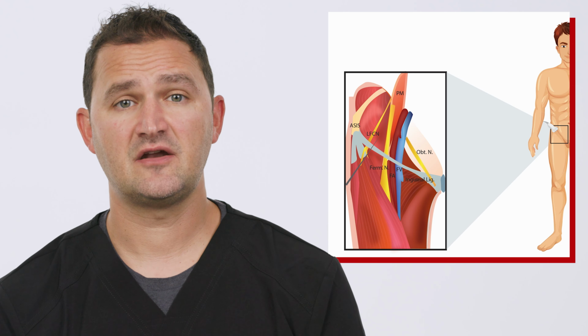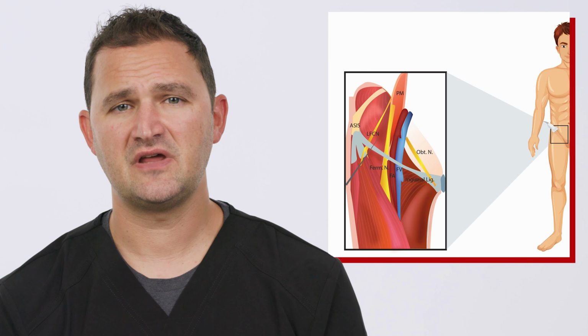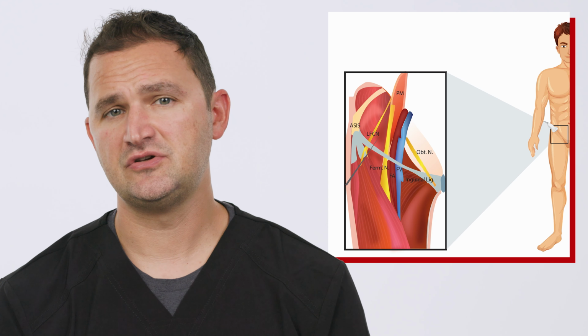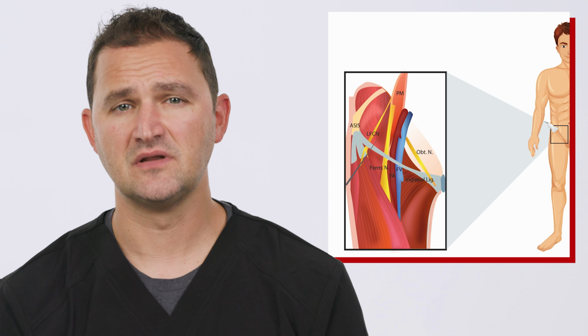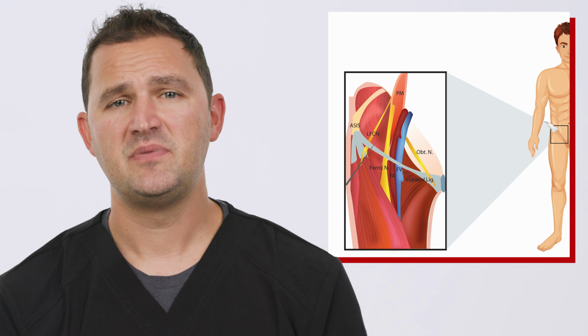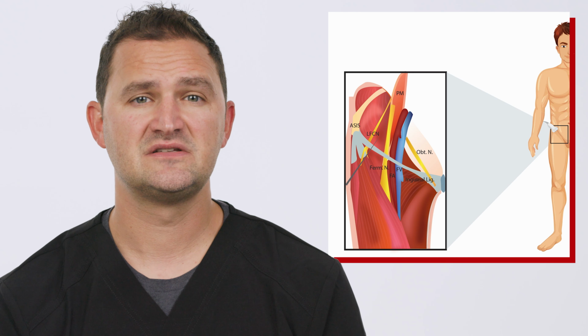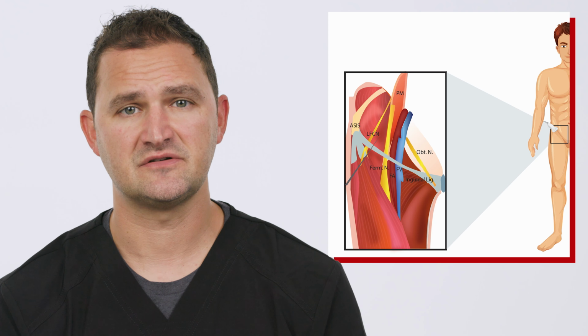For fascia iliaca blocks, we want to start at home base at the femoral nerve block, scan our probe laterally, and be sure that you're underneath the inguinal ligament. Generally, I will use the ASIS as a landmark. I want to be below the ASIS when I'm scanning for a fascia iliaca because I need to see the sartorius. The sartorius muscle attaches to the ASIS, so if I'm too cephalad to that, I won't see this muscle.